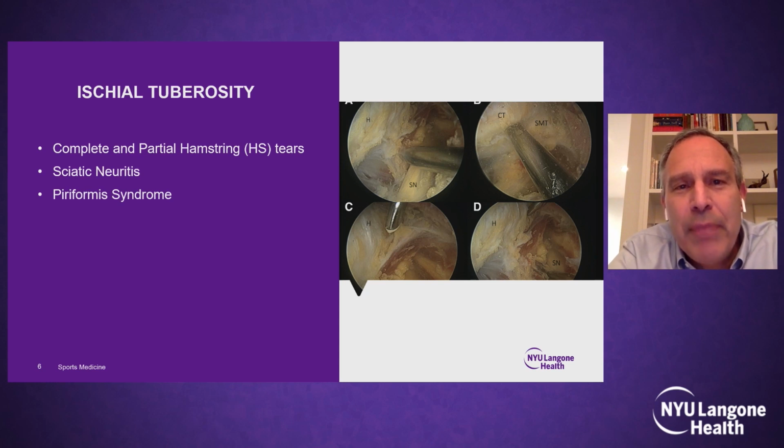Just buyer beware that you have to work on this pretty quickly because there's nowhere for the fluid to exit. So if you plan on being there 3 hours, you're going to have a potential compartment syndrome or blown up hip. So you better be fairly facile and understand the anatomy and have your C-arm so you don't get too lost. And also beware and mindful. You may want to spend some time in the cadaver lab just looking at the proximity of the sciatic nerve.